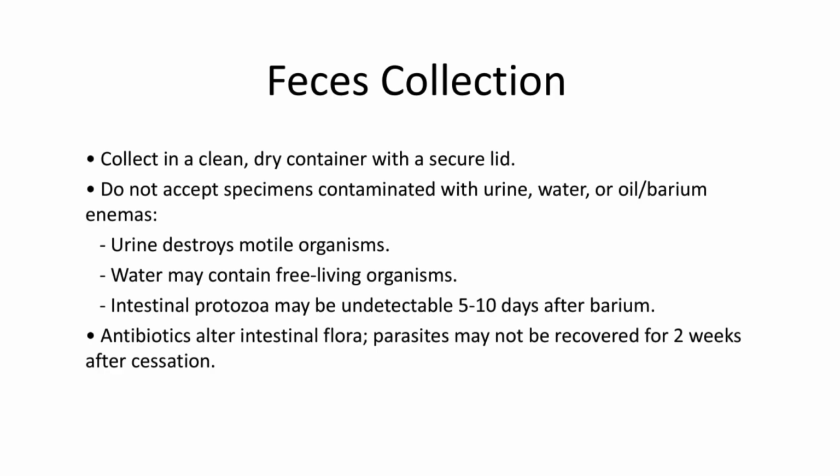For fecal specimens, collection must be done in a clean, dry container with a secure lid. Specimens contaminated with urine, water, or barium oil enemas are not acceptable. Urine can destroy motile organisms. Water may introduce free-living organisms, and barium can mask intestinal protozoa for up to 5 to 10 days after administration. Additionally, antibiotics alter intestinal flora, and parasite recovery may not be possible until 2 weeks after the last dose.